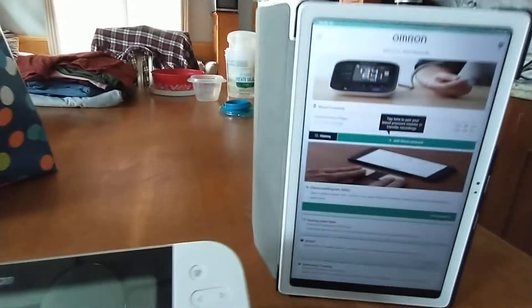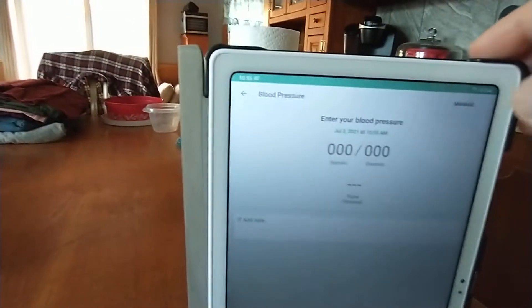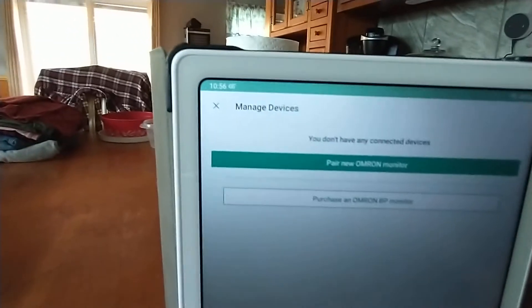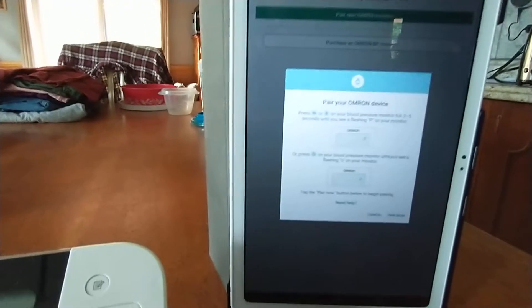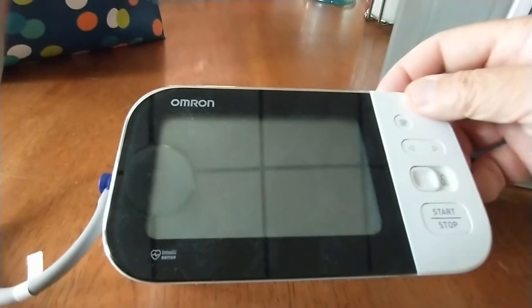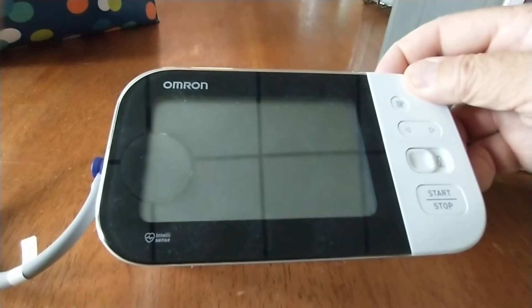So now I go to the Omron app and press 'Add Blood Pressure,' and in the top right corner there's 'Manage.' You hit Manage and it says 'Pair New Omron Monitor.' Hit that. And what it tells you to do is press the little button on the back of the blood pressure monitor for about two seconds.